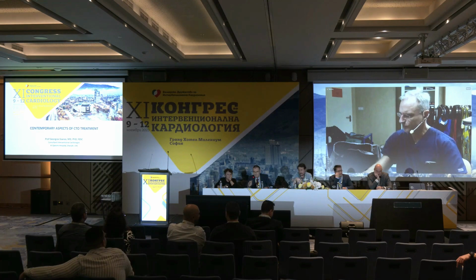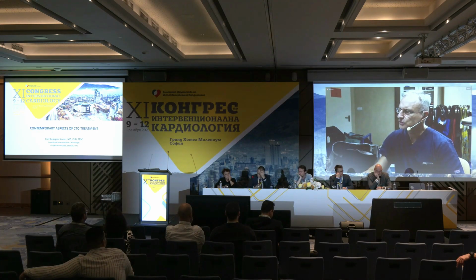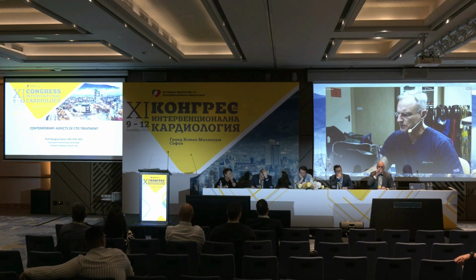Hello, George. Hello everyone. We are also preparing here for a live case. We have a very nice CT of the right coronary. I'll just try within 5-10 minutes maximum to update you a little bit about some aspects of the chronic total occlusions.